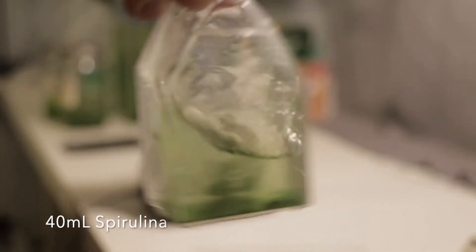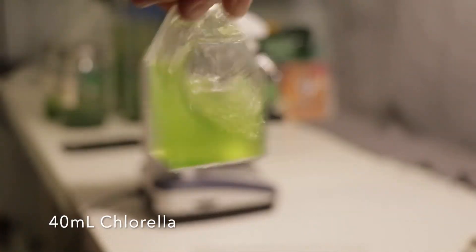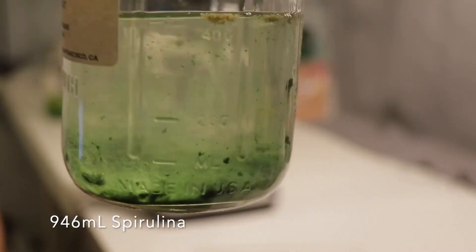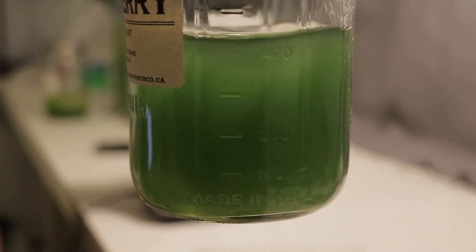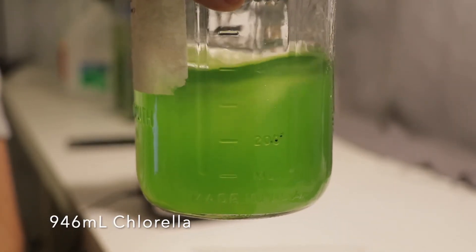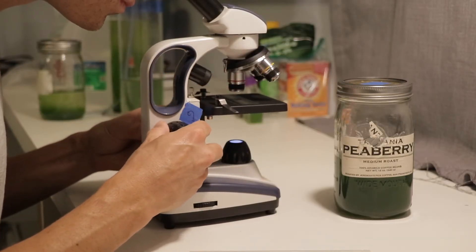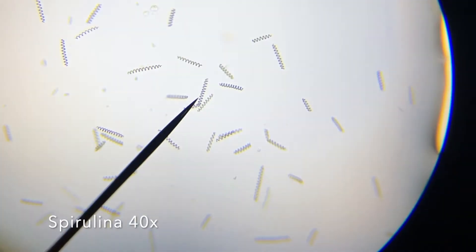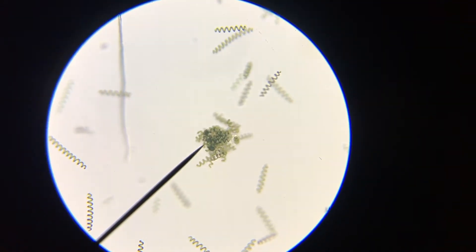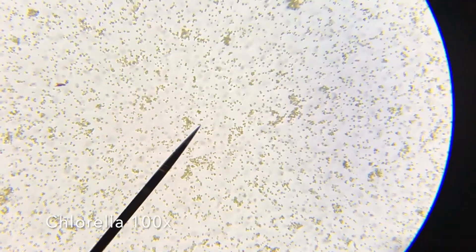One of the things I wanted to highlight in this video is the overall visual density of the algae. Both my spirulina and chlorella are doing very well at this point, 46 days in, and in all three containers — the 40-milliliter flask, the 32-ounce mason jar, and the 1.6-liter glass tube — everything's done really well. There's been no contamination, the algae under the microscope looks very healthy, and even the little bit of fungus on the inside of the lid had zero effect on the health of the algae.